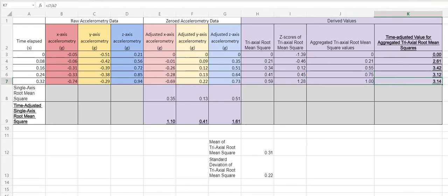The final time points values for each trial with the aerosol box was compared to the final value for the corresponding trials without the aerosol box via Wilcoxon-Signed Rank tests to assess whether intubations involving an aerosol box led to statistically significant differences in hand accelerometry, as depicted in Table 3 of the manuscript. The values from this method were also used to graphically compare how general accelerometry differed between corresponding trials, as depicted in figures 5 through 14 of the manuscript.